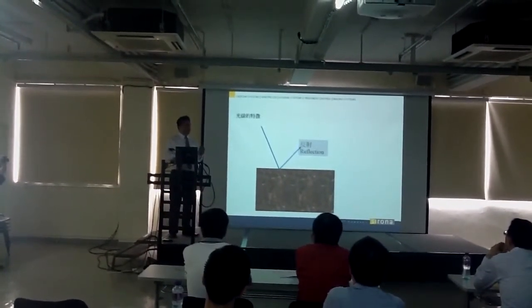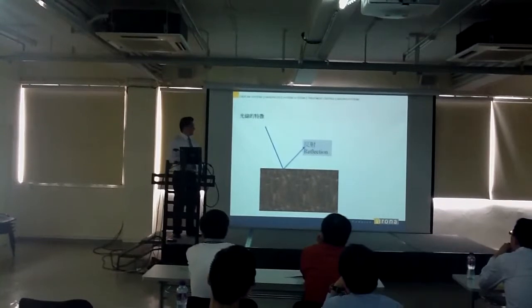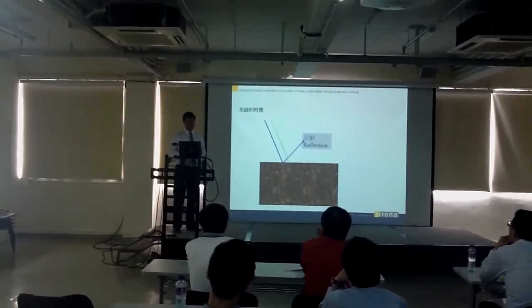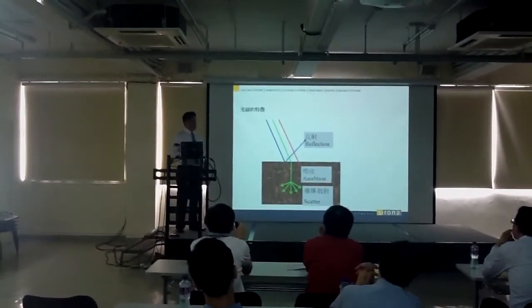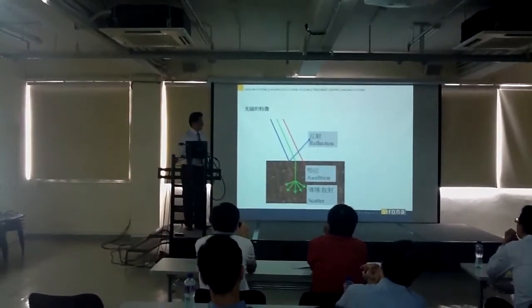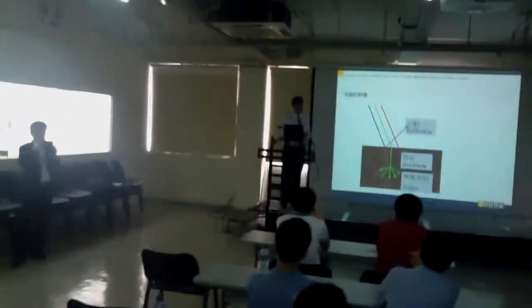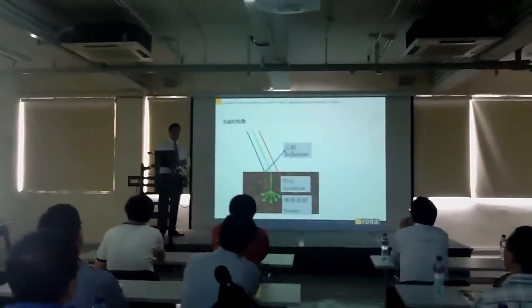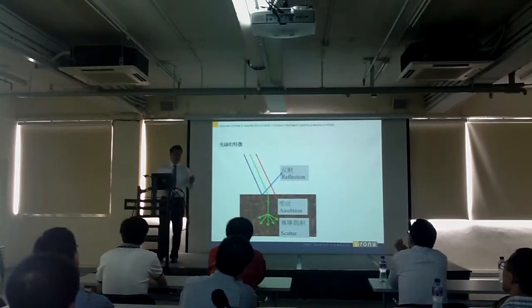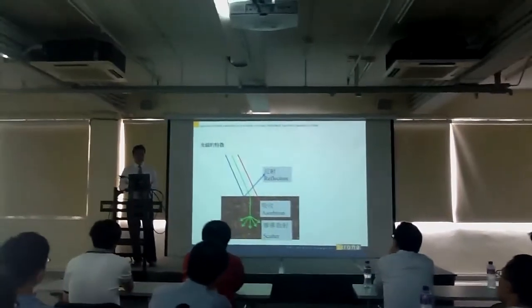So when a beam of light hits an object, three things happen. Number one is reflection. Number two is scatter. Number three is absorption. As clinicians, you have to watch out for reflection into your eyes. It's the absorption that helps you work. The scatter is what you want to watch out for, as damage to the patient. These three things mean different aspects when you are working in medical.